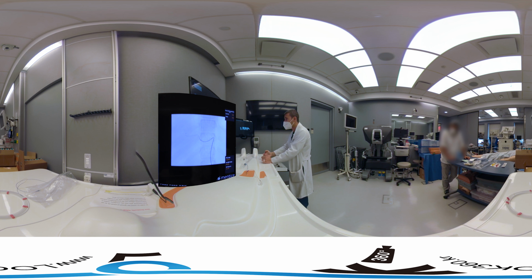So you're going to see me here now slowly delivering through a small 3 cc syringe or 1 cc syringe directly to the tumor. And you can see that I just pulse it in slowly to try to avoid reflux. You know, we can take our time with this just to make sure it's going directly to the tumor and that we're avoiding getting reflux, because we want to get as little non-target embolization as we can.